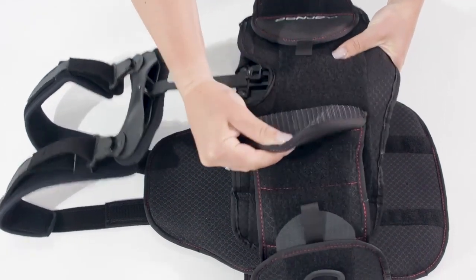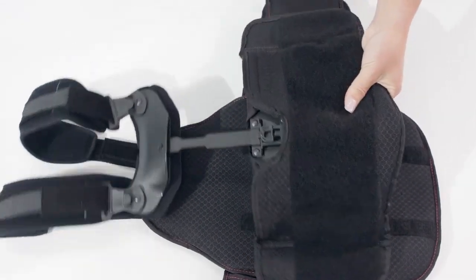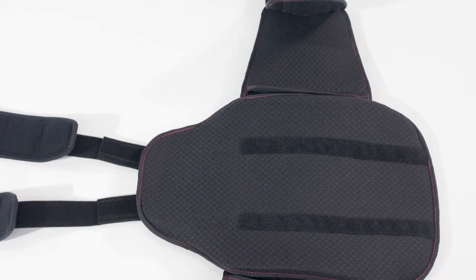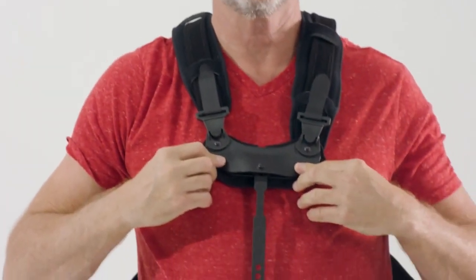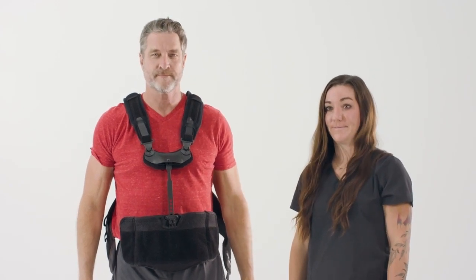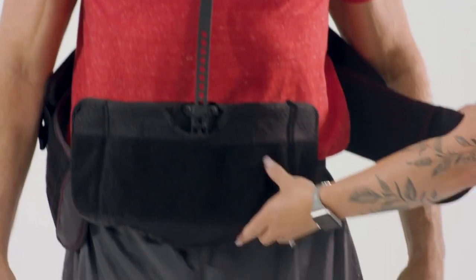Open both of the interior side velcro panels, keep the shoulder straps attached, and extend to maximum length. With the patient standing, lift the TLSO over the patient's head and lower the TLSO into position, keeping the patient's head between the two shoulder straps. Let the front interior panel and back posterior panel hang over the torso.